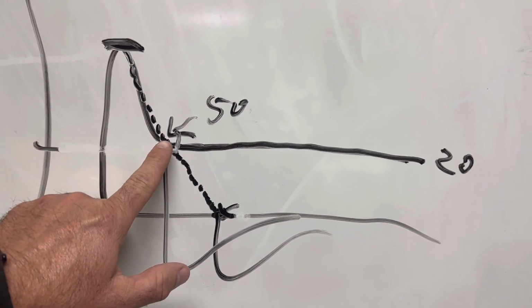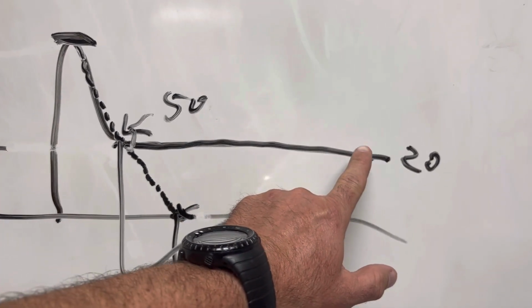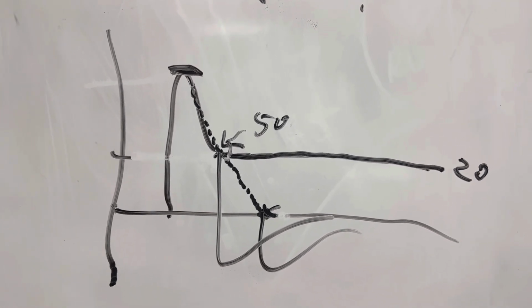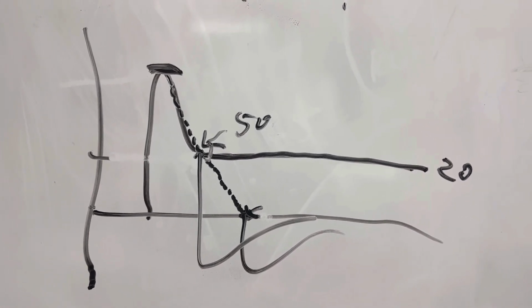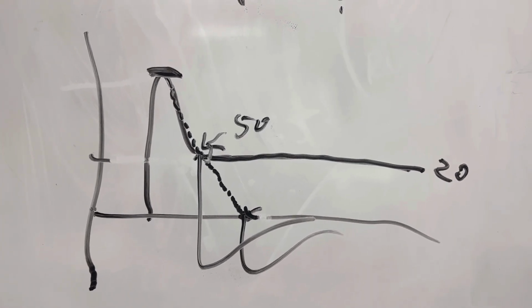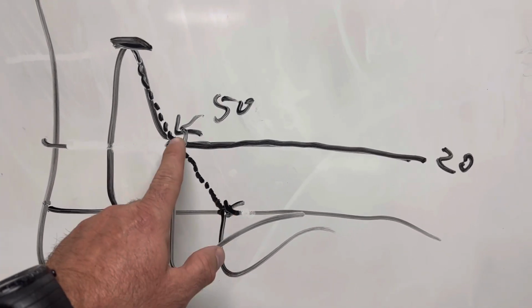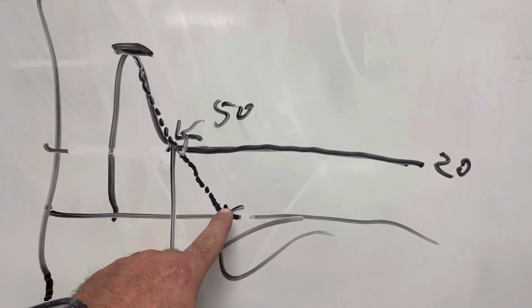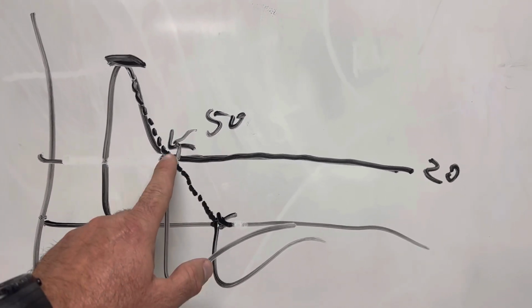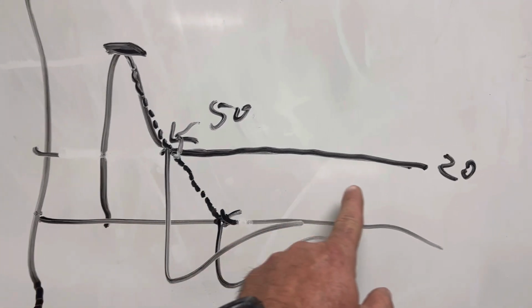And then at about this point, you have a constant flow from the vent at 50 liters per minute. The reason this is occurring is because the patient has a leak, and the vent is required to push a certain amount of flow through that leak in order to maintain the pressure, right? Well, you have the inspiratory cycle set at 1, so it's waiting for this flow to slow down to here. It's never going to slow down, because if it does, the pressure it's targeting would drop. So it has to keep this flow up, and thus the inspiratory time becomes this long.